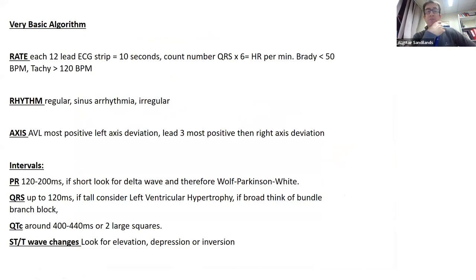So let's look at a very basic algorithm. You're shown an ECG, and you do not know what the ECG shows to start with. Then you should start off having a framework that you use every time you're looking at an ECG, unless you can get the abnormality straight away. You'll have come across this before. This is well known in ECGs.